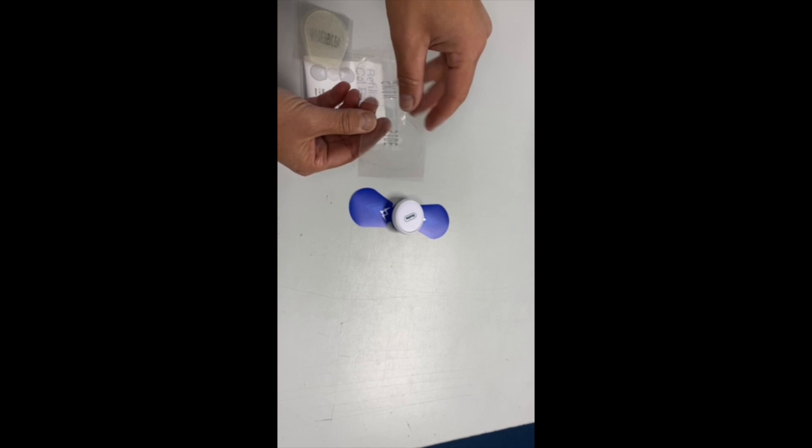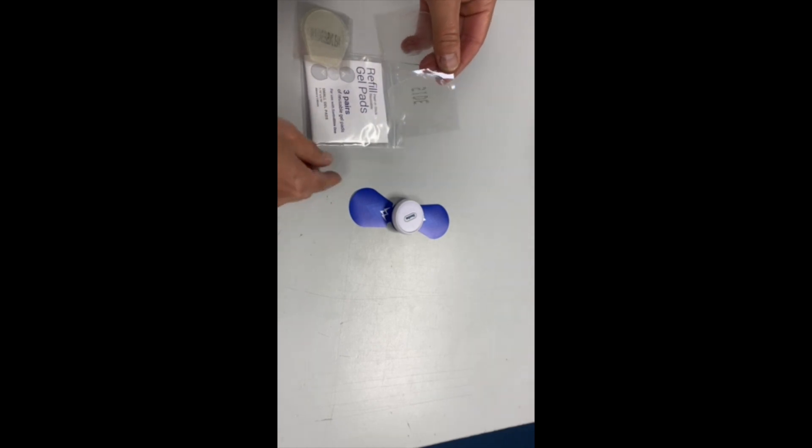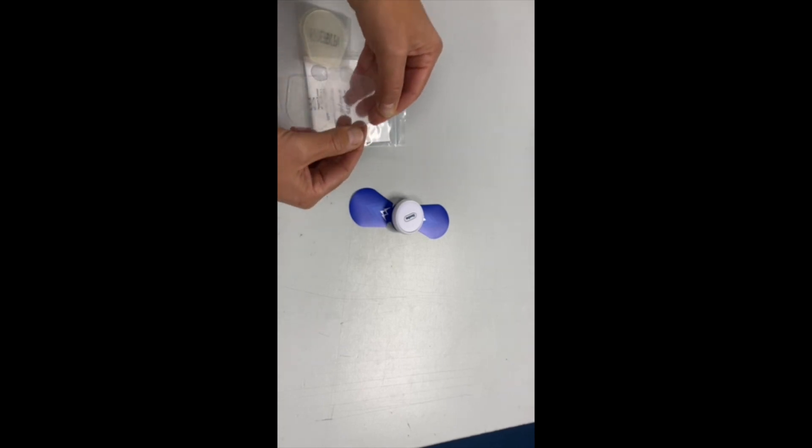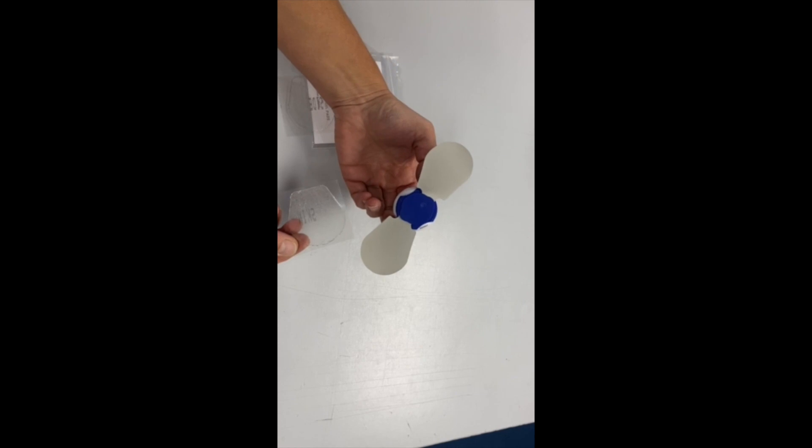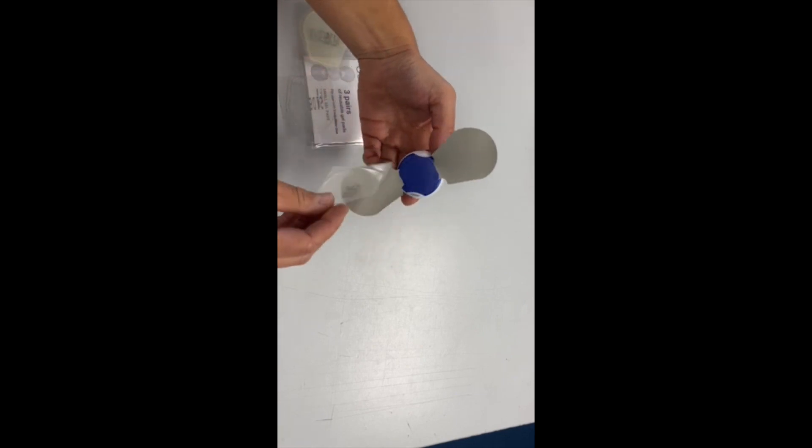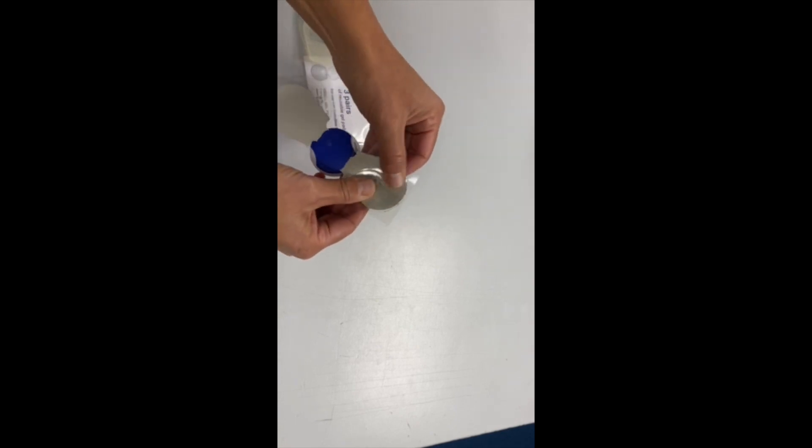You're going to take off the softer, thinner piece of plastic to reveal the gel electrode. You can split the pair in half, and then you're going to stick it to the underside of the silver wings, lining it up and pressing down smoothly.